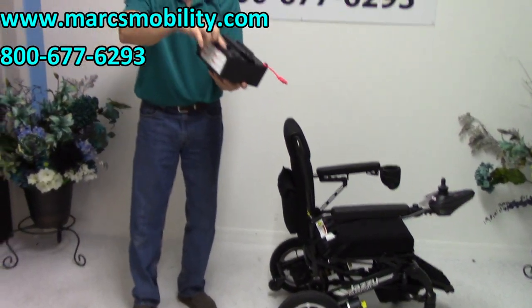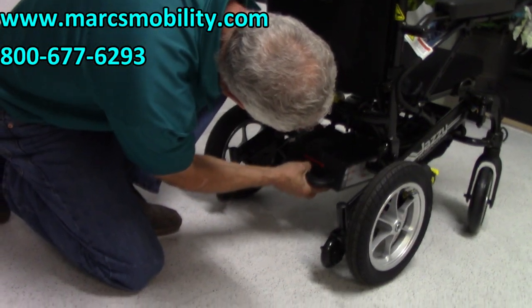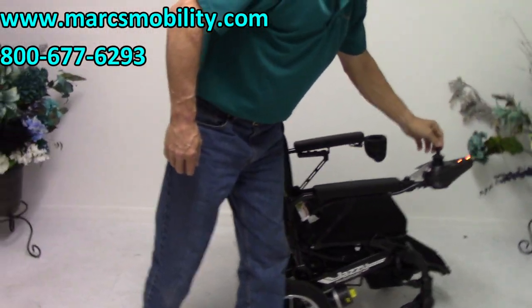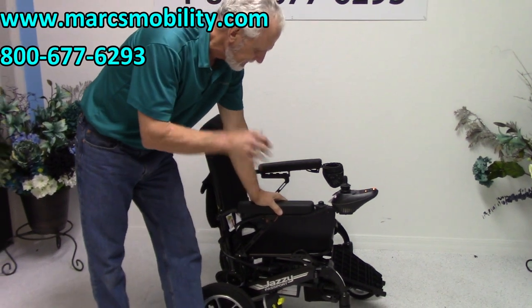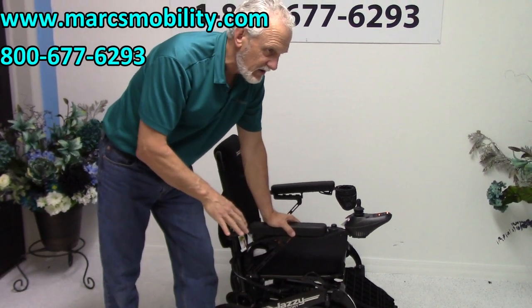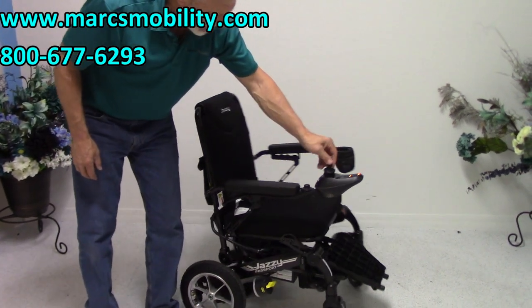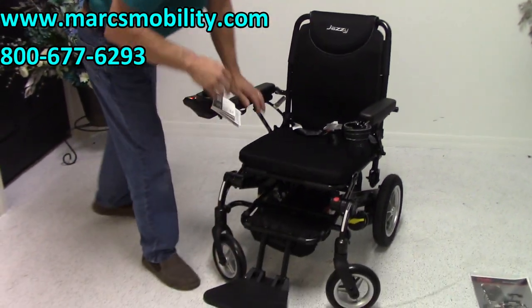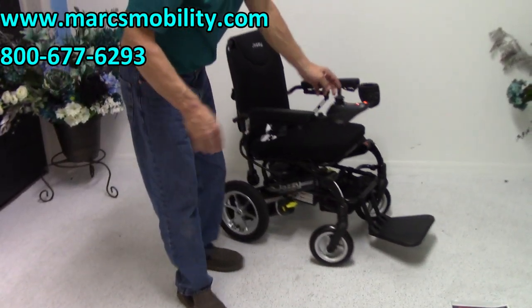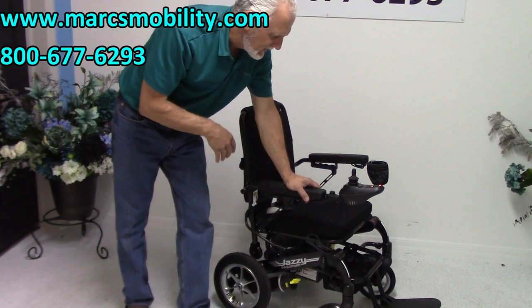The battery pack slots in on both sides and locks automatically, restoring power. This chair has five speed settings; the top speed is 3.6 miles an hour. With the standard battery pack, you'll get anywhere from 9 to 11 miles of range depending on the weight of the user, terrain, and incline. With the smaller airline-approved battery pack, you'll get between five and seven miles.